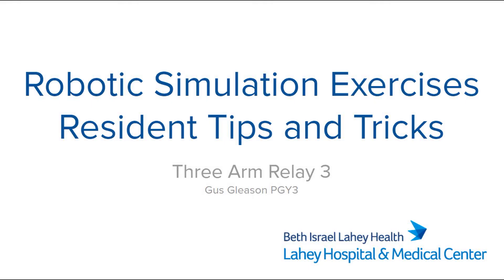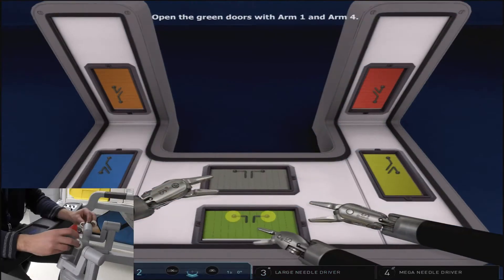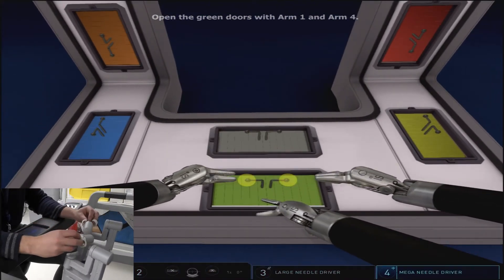Three-arm relay three is an even harder iteration of the three-arm relay exercises. The big difference is that you are now required to place shapes in panels that are both flat and at a vertical orientation.